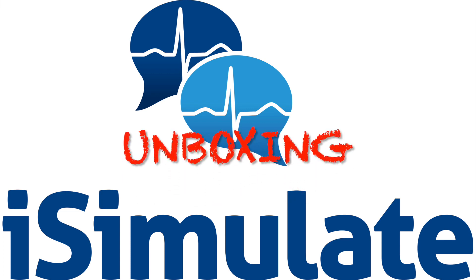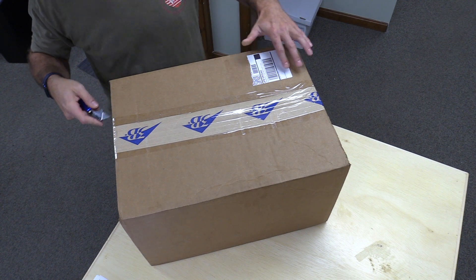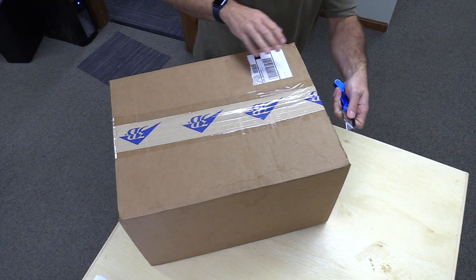Hey everyone, it's Matt with iSimulate, excited to unbox your new Reality 360 kit. Once you've got the kit, let's go ahead and slice that box open and get started.